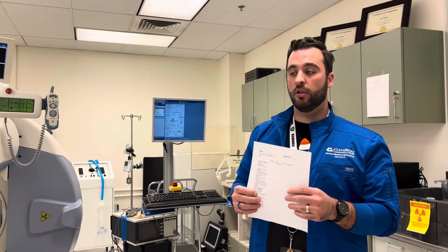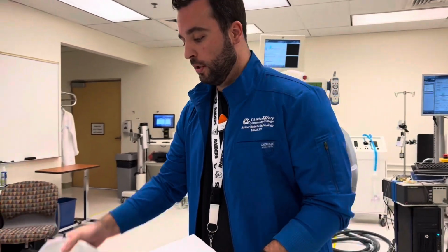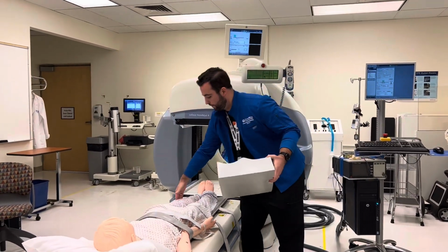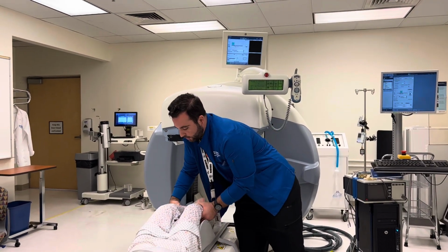We're going to start with a lateral static of the head, so you're going to determine the position of the head, mark that in your field of view on the camera, and then set up your patient acquisition. Okay, so first we're going to get our patient comfortable, so we're going to get a knee under Rosie's legs here. You're going to ask Rosie to lift her legs up. You're going to place her legs.